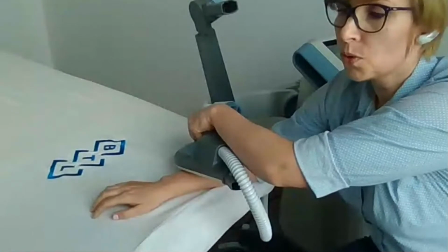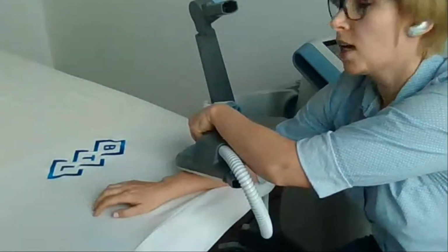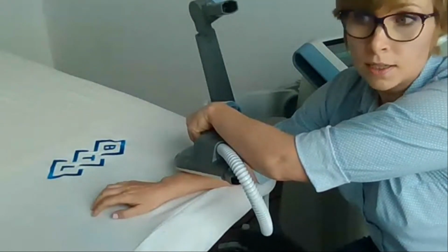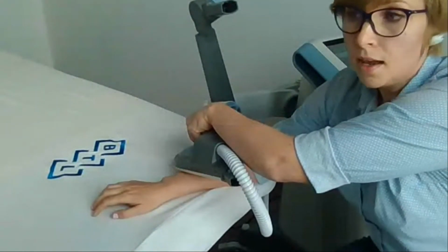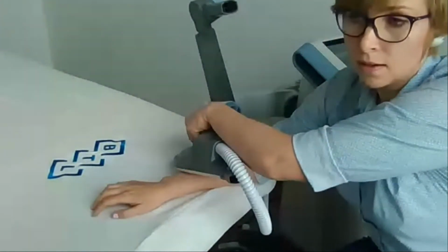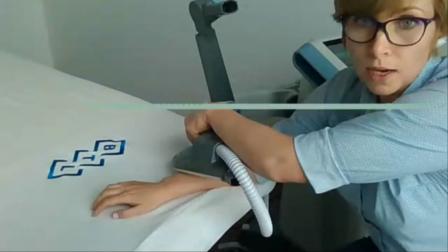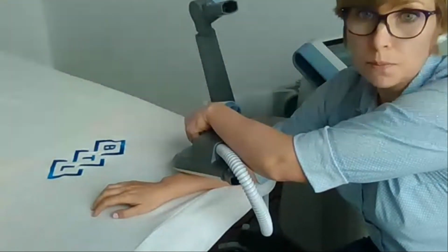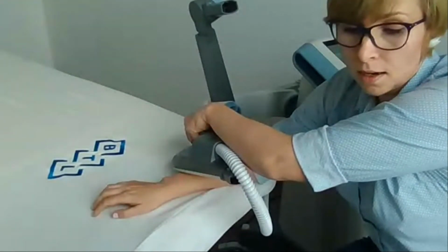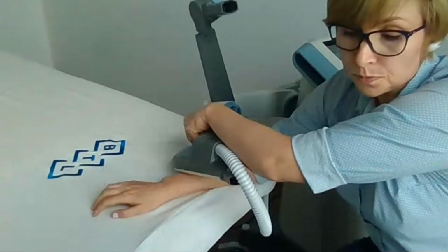I don't need to put a very high intensity of the electromagnetic field. Right now, this is only 9% of the maximum intensity. When I put the program with the nerve repair, I put only 5%. So it is not a big value of the intensities we need to load.